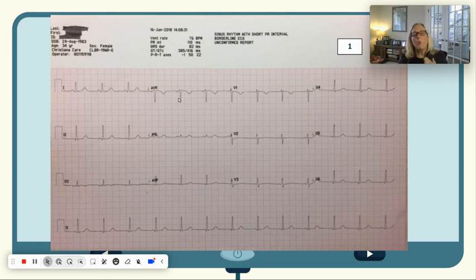All right, so back to what the real thing is, the heart axis. We're looking for the largest QRS of these 6. This one, this one, this one, this one, this one, and this one. We can do Einthoven's triangle. Remember, 1 plus 3 should equal 2, which it does. Stack this on top of that, and that should equal that. It does. Einthoven triangle checks out, and our AVR is negative. So we know this EKG is hooked up properly.